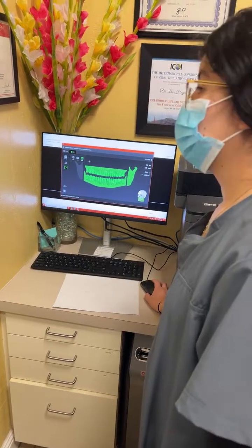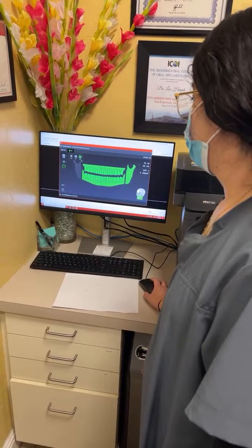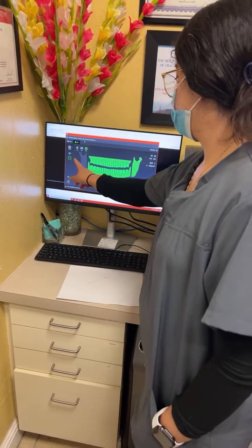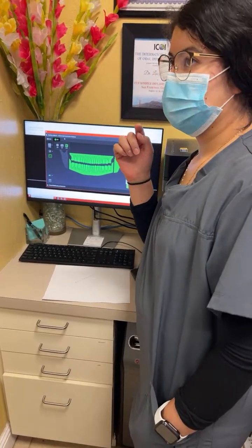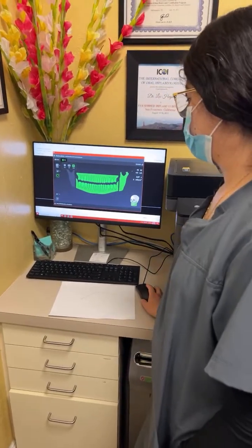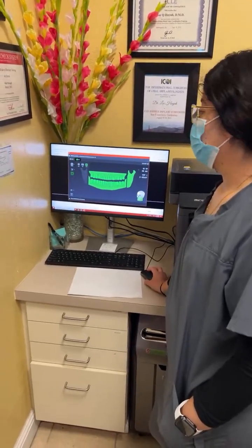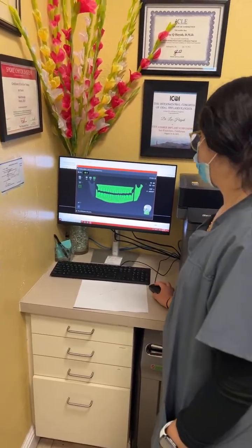If it's 9x14 and that's what you purchased, then we just put a code in and it activates it. It's like a Tesla. You put the update in and it updates it. I need the bigger one for panel for auto. The 14 one is everything. If you purchase the 9x11, then you don't get the second condyle, and you would have to either scan them again or get the upgrade for that. I thought I got the biggest one. You might have a look. Yeah, we got the bigger one. If you did, then all I need to do is get a code for you. Okay. And then it would appear here. And we select it. Email sent.